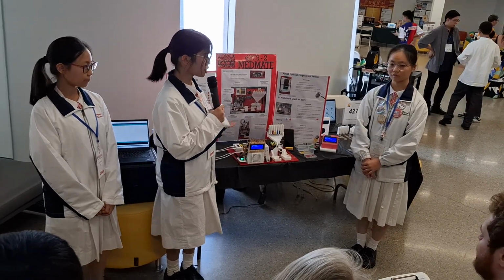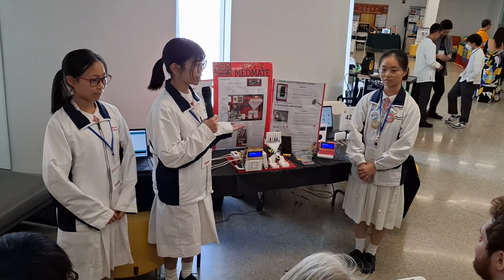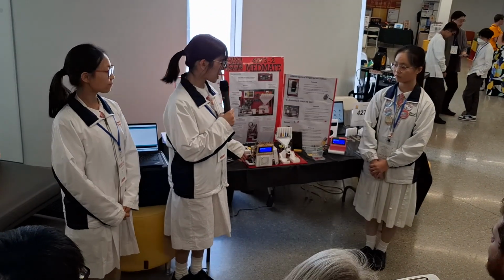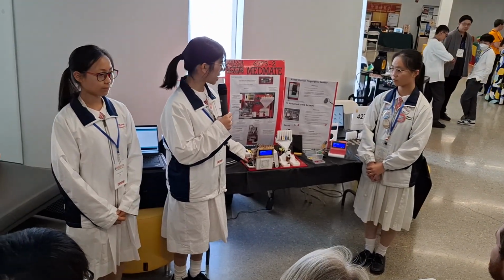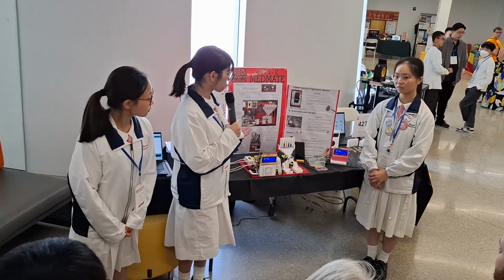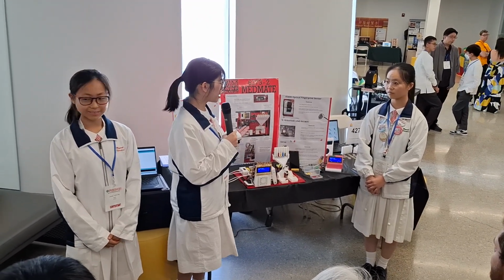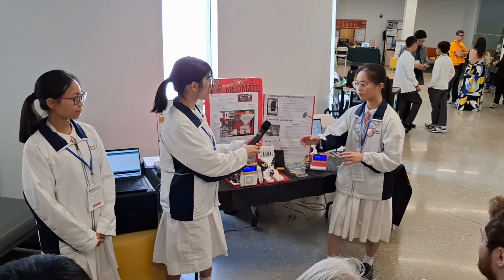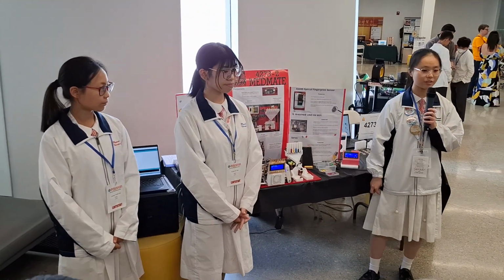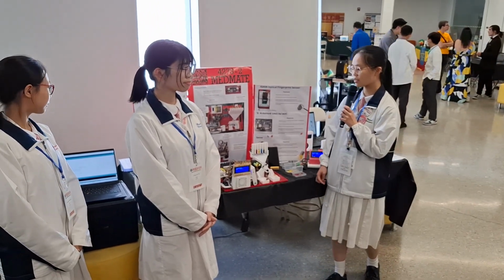For the dispersal of pills to begin, the device has to confirm the identity of the user. The users will have to save their fingerprint data in the AS608 optical fingerprint sensor in advance. Once the patient presses their finger on the sensor and the device recognizes the fingerprint, the dispersal of pills will begin. During the dispersal, the servos will coordinate with each other to allow the appropriate amount of pills to fall to the correct place.